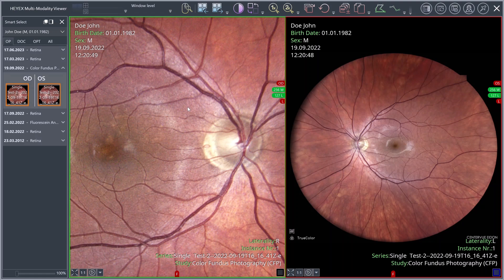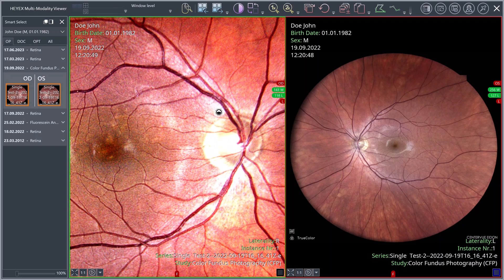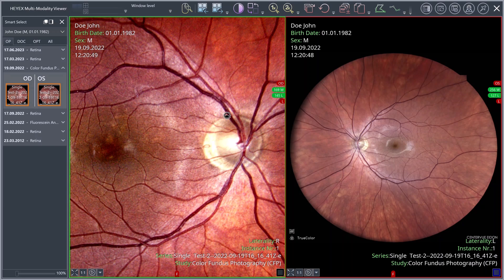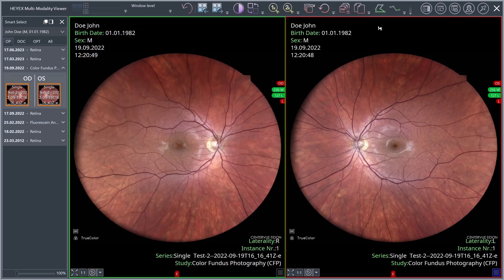Brightness and contrast of an image can be easily adjusted by moving the mouse pointer horizontally and vertically while holding the left mouse button. You can edit the contrast with a horizontal movement and the brightness with a vertical movement. If you want to reset any adjustments, click the Reset Selected Images button from the image tools category.